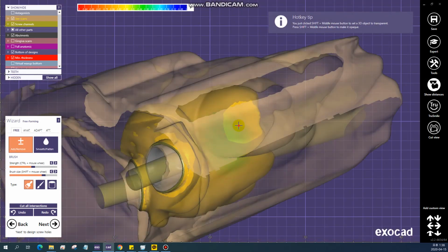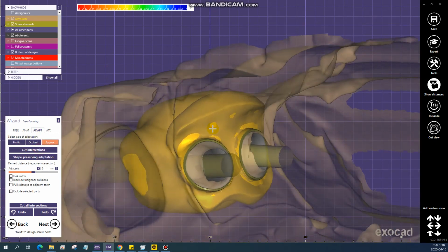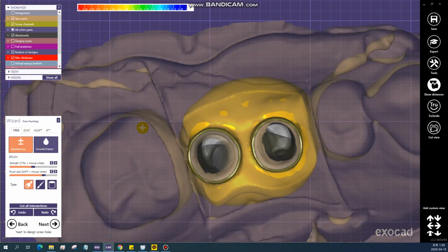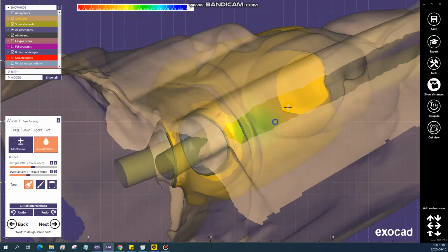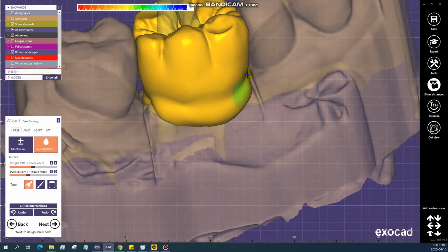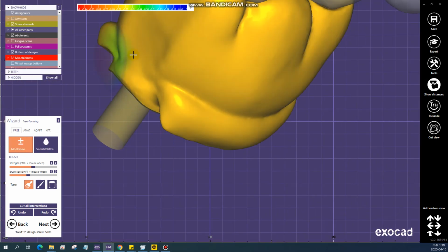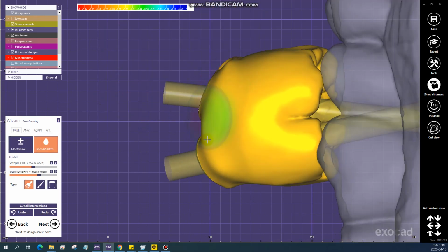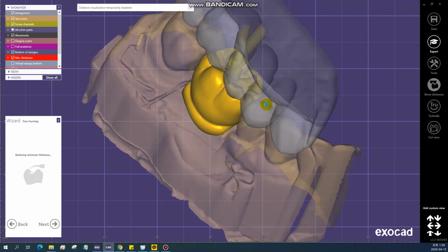And here's the part where I need to adapt into the proximal, but you can see it didn't work, right? Because I merged them with each other. So you have to make it manually, but that's easier for you. And smooth surfaces, and almost done. Even in 10 minutes you can design like this.